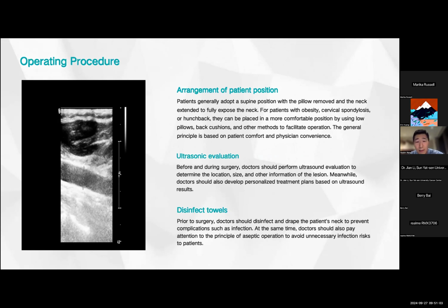And the following one is the ultrasonic evaluation. Before and during surgery, doctors should perform ultrasound evaluation to determine the location, size, and other information of the lesion. Meanwhile, doctors should also develop personalized treatment plans based on ultrasound results. Prior to surgery, doctors should disinfect and drape the patient's neck to prevent complications such as infection. So also pay attention to the principle of aseptic operation to avoid unnecessary infection risk to patients.